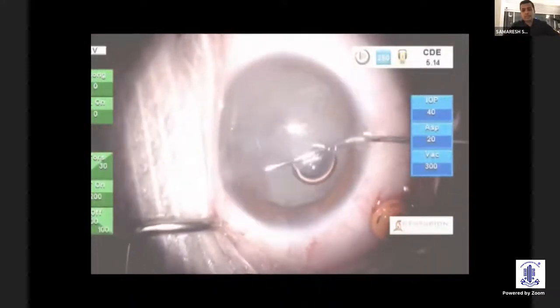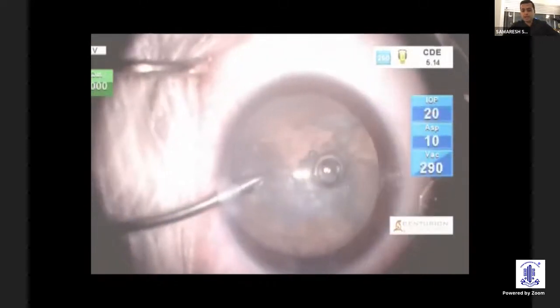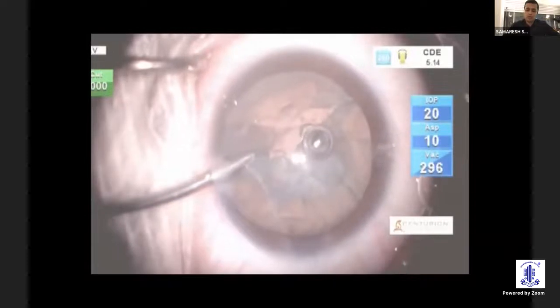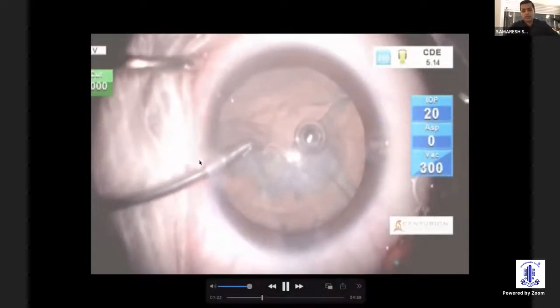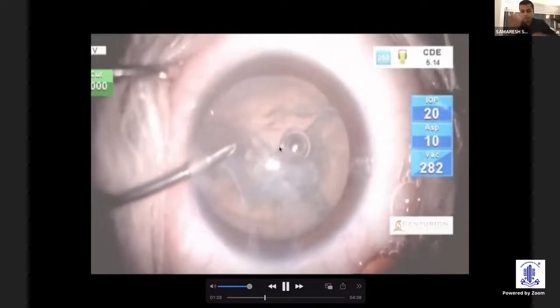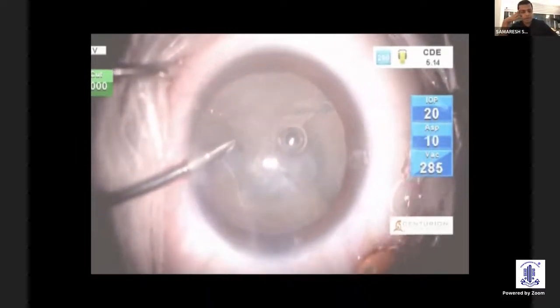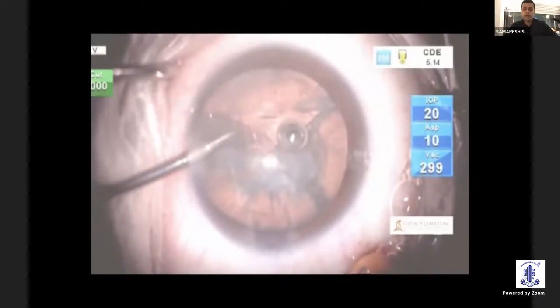When a situation like this arises, I think it's our duty and responsibility to first identify the vitreous. And having identified this, for the last almost 6-7 years, our go-to choice is to do a pars plana vitrectomy. So we have a limbal irrigation and a vitrectomy probe through a trocar cannula system, where I'm underneath the posterior capsule, clearing up the vitreous, preventing it from prolapsing anteriorly. And I'm using the irrigation anteriorly to keep the anterior chamber stabilized.